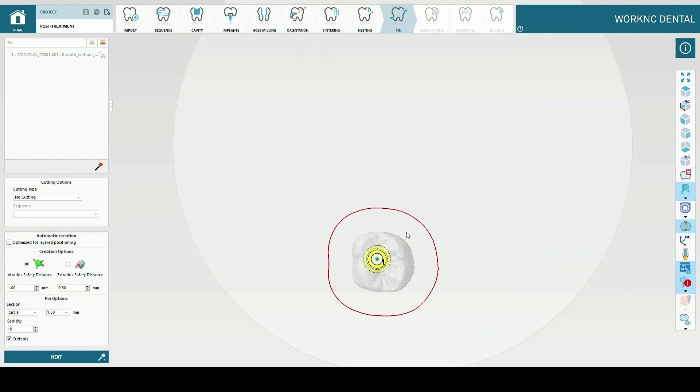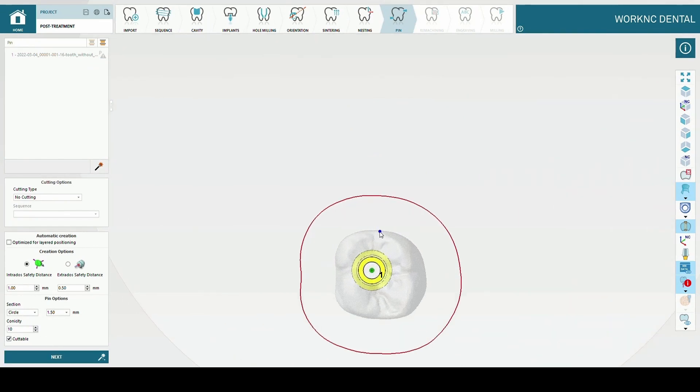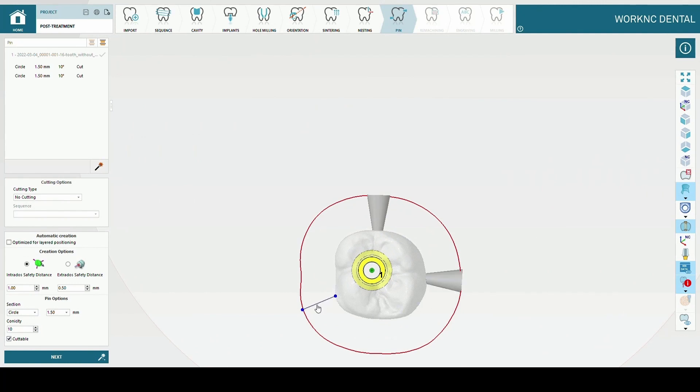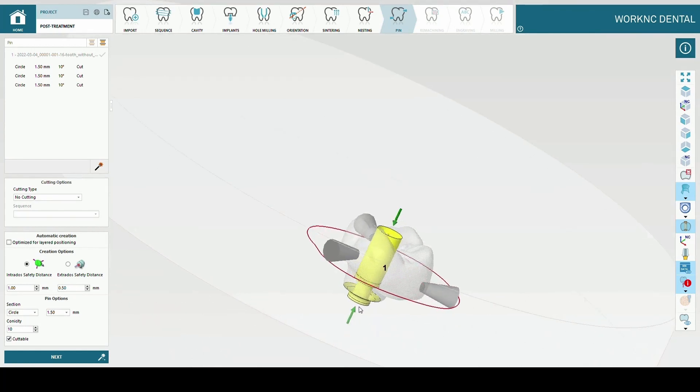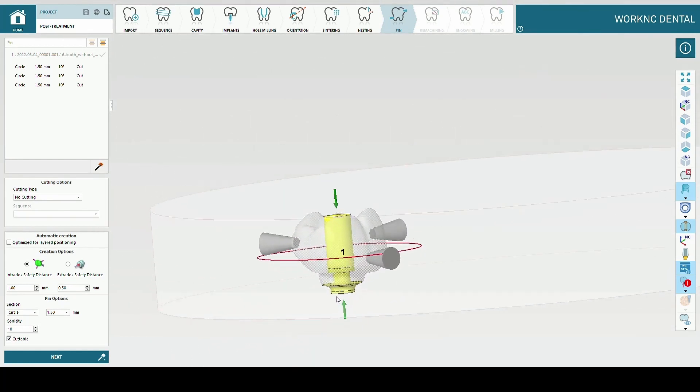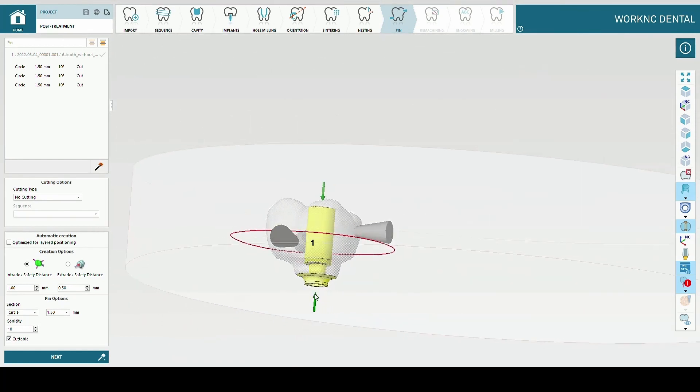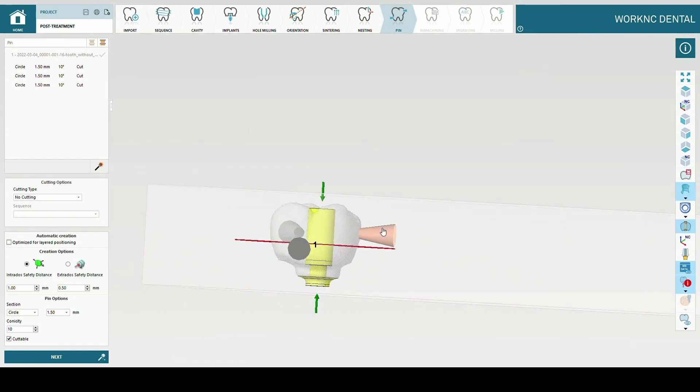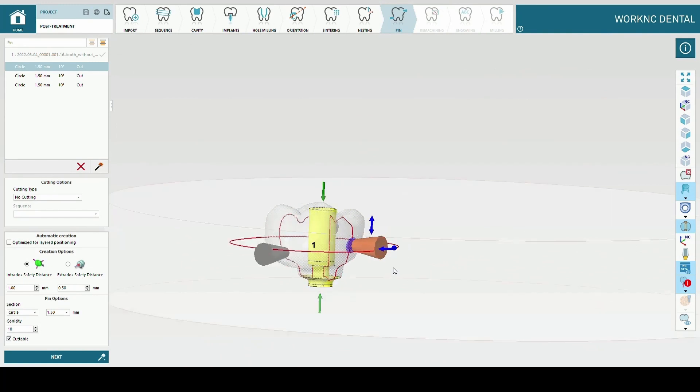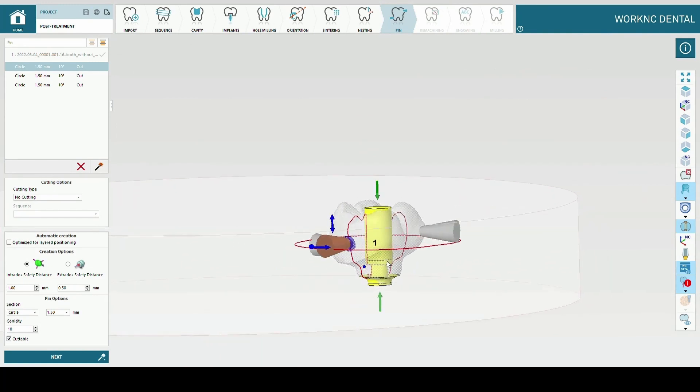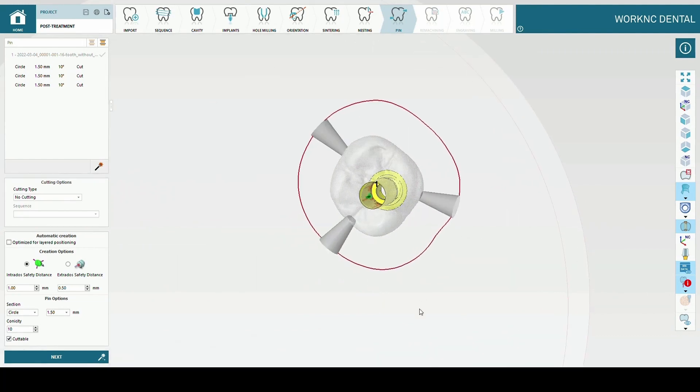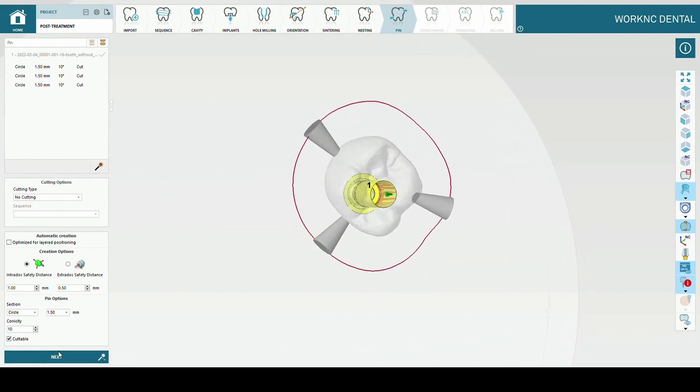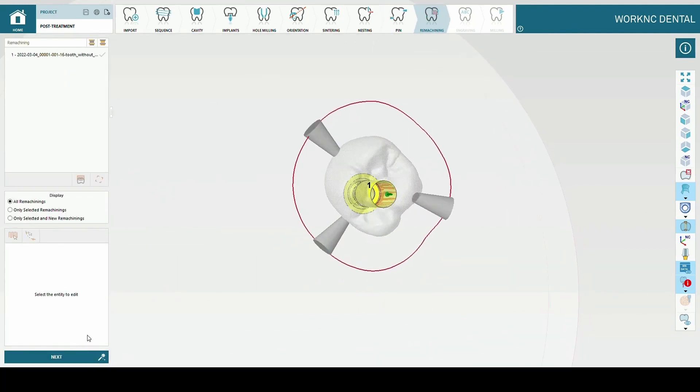Click next. In this step you can add sintering support manually. When ready, click next.